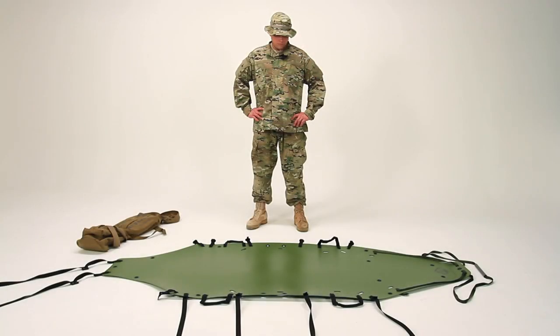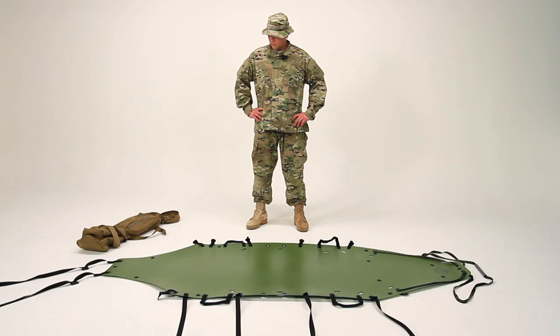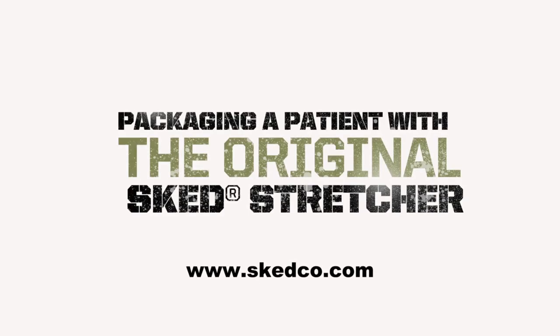Now the Sked is ready to use. You can find the steps for packaging a patient in the printed instructions that come with your Sked, or in our video, Packaging a Patient with a Sked Stretcher at skedco.com.